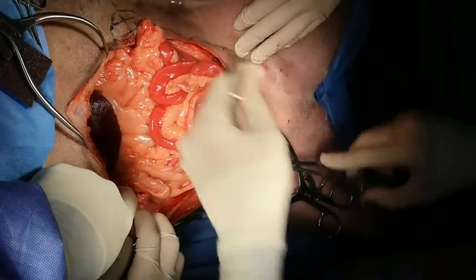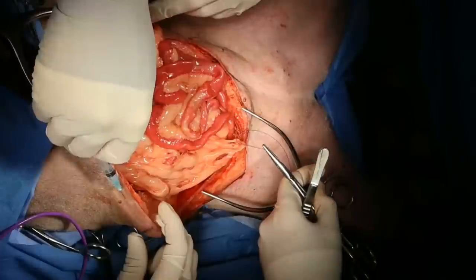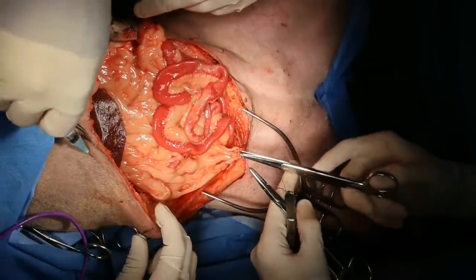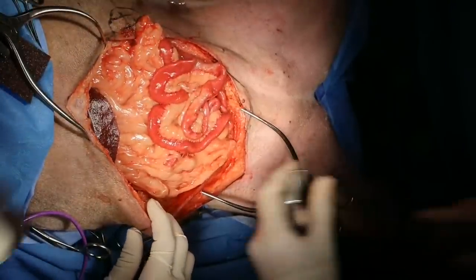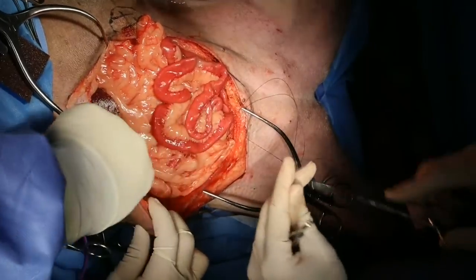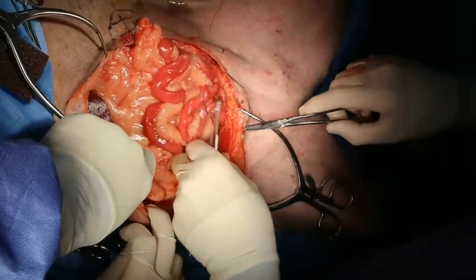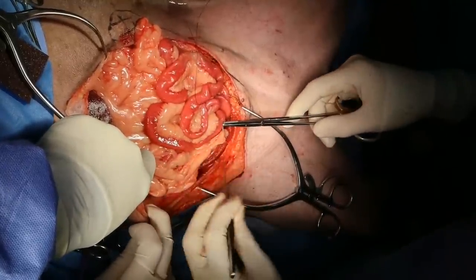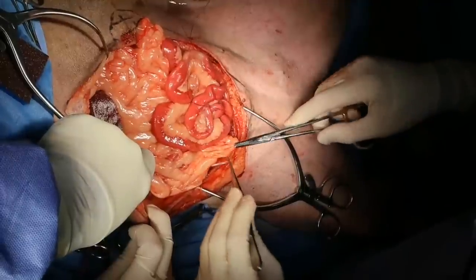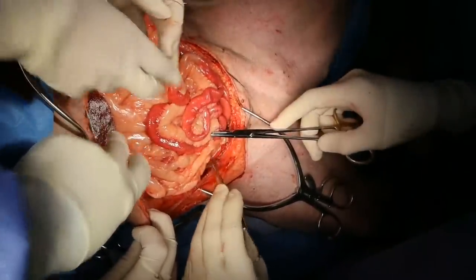So I'm suturing omentum to close the defect first, and then we'll suture polypropylene mesh on top of that. The purpose of the omentum is to keep the intestines from rubbing up against the mesh. So I'm basically suturing omentum to peritoneum.